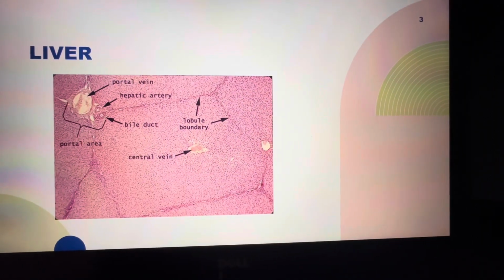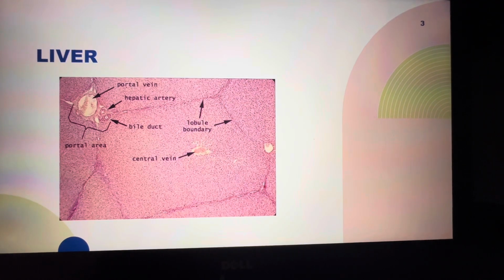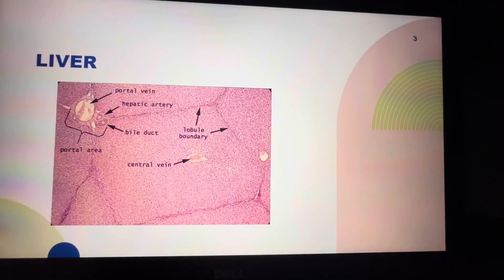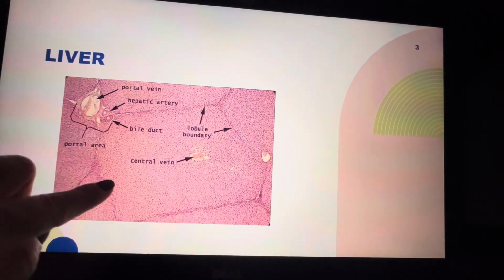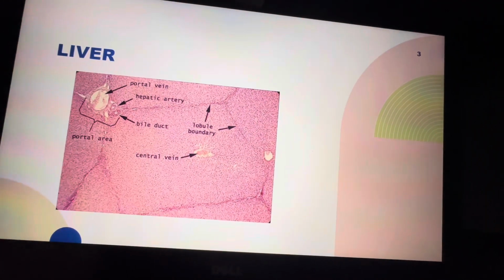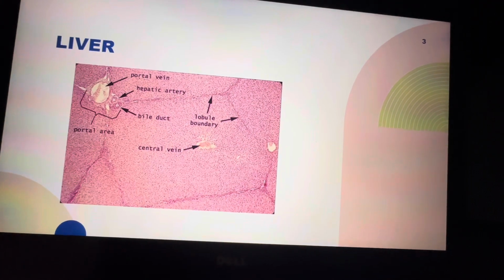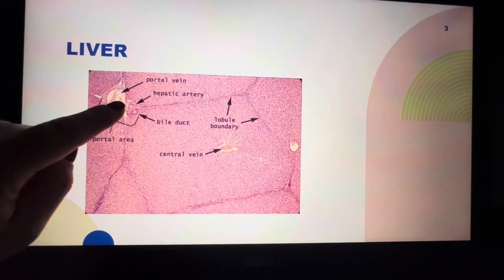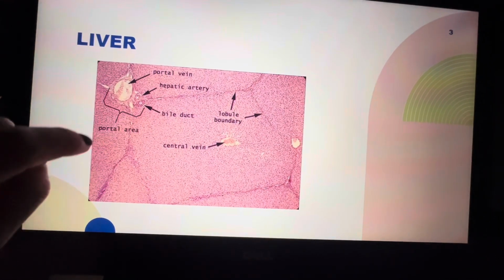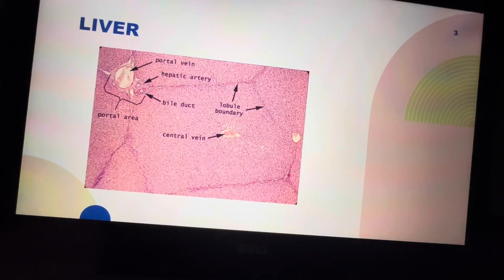Up next, we have the liver. The liver is going to have quite a bit in these layers. The first one would be the lobules, which you would see kind of the marks here. In the lobule, you'll see the central vein. And then we also have in this picture here the hepatic triad. So you'll be seeing the bile duct there. You see a portal vein and the hepatic artery in there as well.